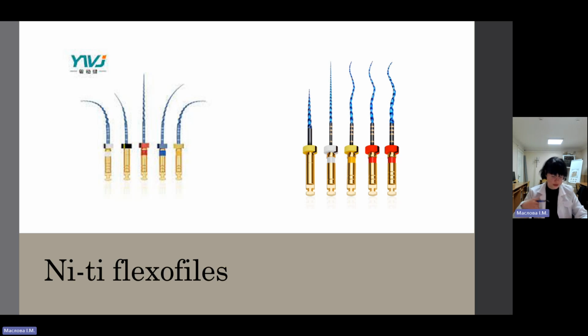The concept of using NiTi for endodontic instruments came from orthodontics, where its properties have been utilized in the archwires of fixed appliances. The NiTi alloy used for root canal instruments is known generally as nitinol: Ni for nickel, Ti for titanium, and NOL for Naval Ordnance Laboratory. The manufacture of NiTi endodontic instruments is more complicated than that of stainless steel. The majority of the instruments are machined.